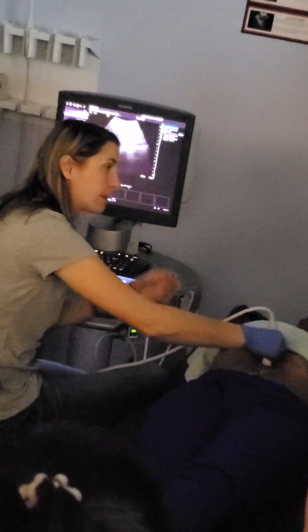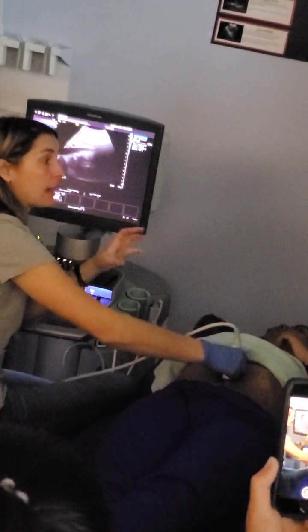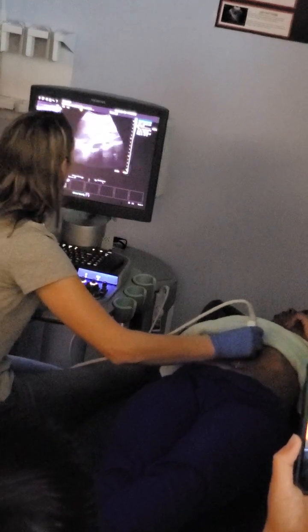So once we find that main lobar fissure, you're going to find the neck of the gallbladder, and then you're going to have to swing around and maybe move laterally or move medially to try to lengthen it out. That just gives us the location, but it doesn't elongate it. So we have to elongate it after that. So we're going to big breath in. So we went to that.